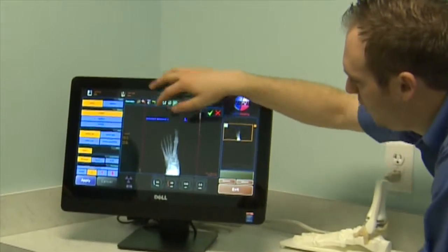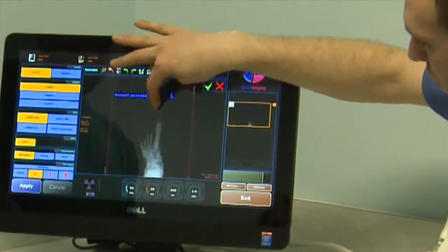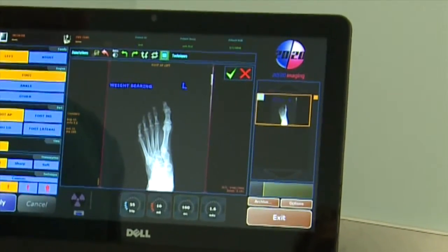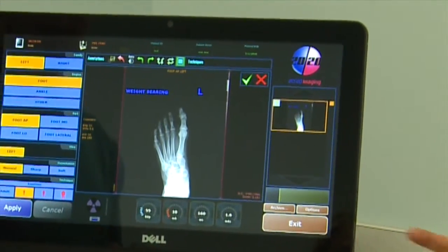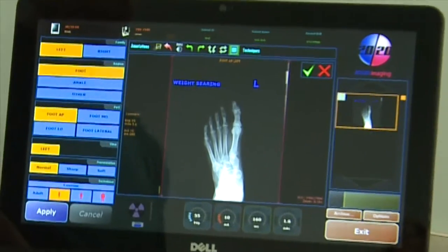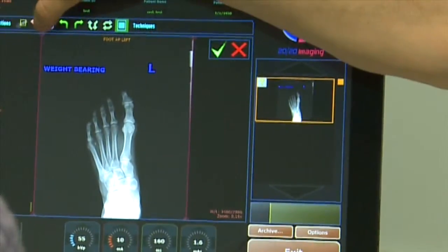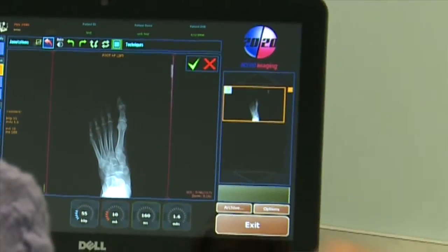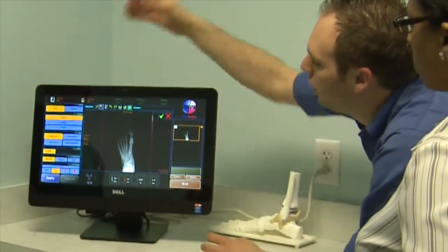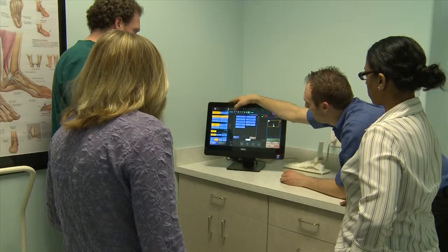Up here you have a Reset button. If you drag on the image, you can adjust the contrast, but it's normally going to be contrasted well as long as you're doing everything right. If you want to reset, you can — it resets the whole thing back to how you just took the x-ray, removing any annotations.